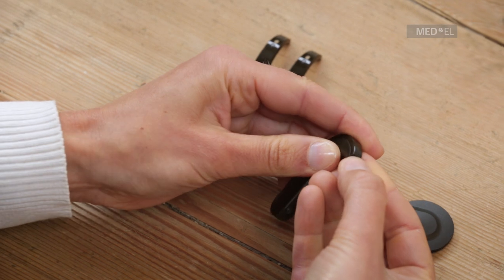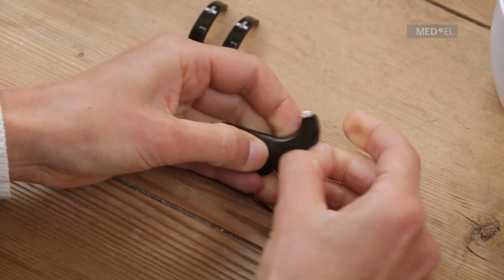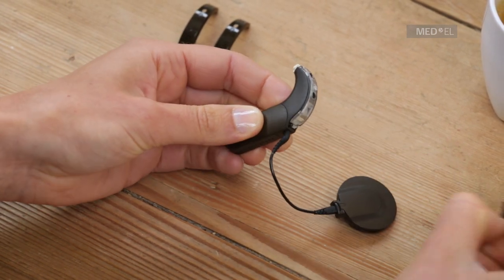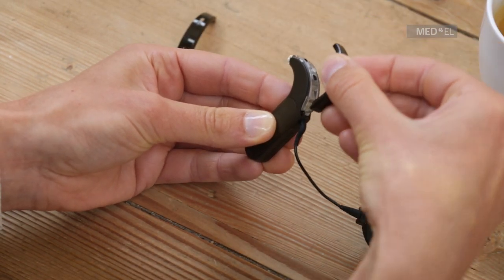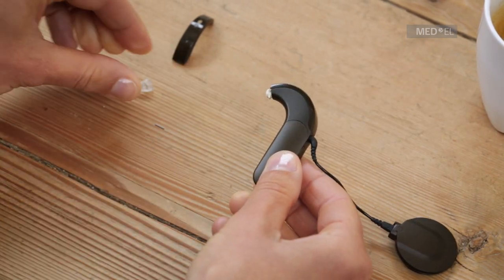Pull the microphone cover off the control unit from the front using your fingernail. Insert the pins of the new microphone cover into the recesses in the control unit. Make sure both pins are in the control unit. Carefully snap the microphone cover onto the control unit.